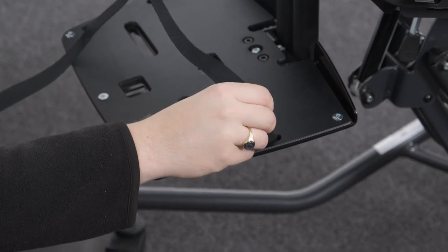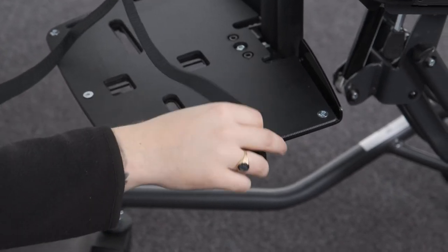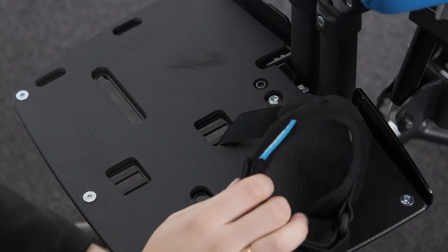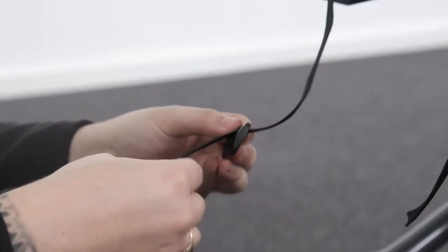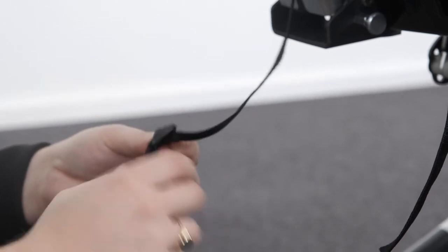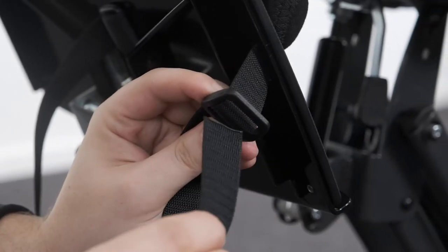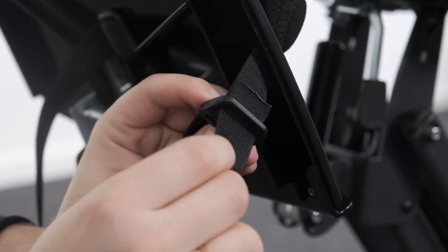Attaching the ankle huggers. Slide the webbing through the side slot in the foot plate. Loop the webbing back up and through the bottom and then top of the triglide. Finally, to lock the webbing in place, pass it through the bottom of the triglide again.